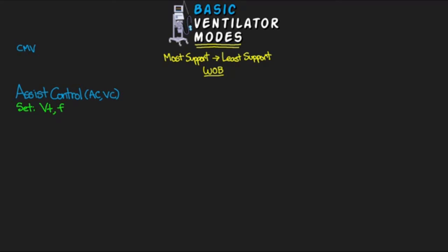In addition to that, we're also going to set an FiO2 as well as a PEEP. Important distinction here is we are not going to have a pressure support. Now, let me try to explain why.